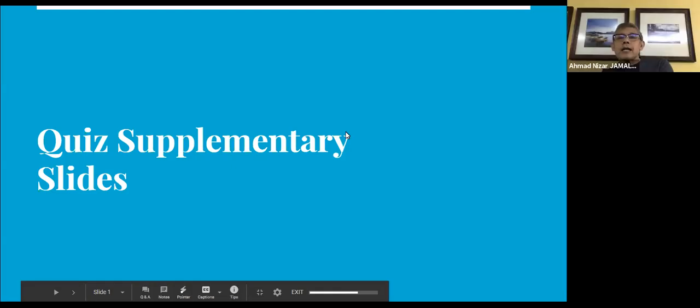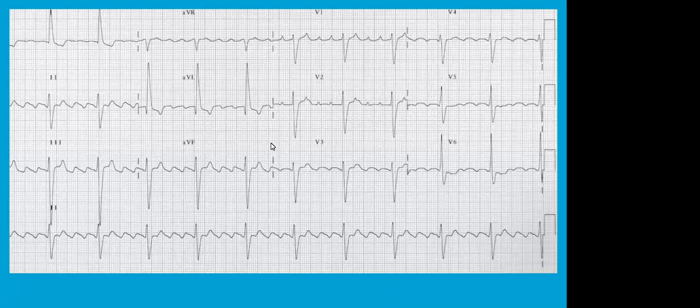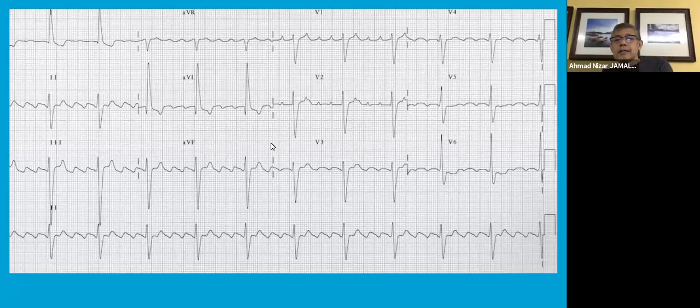Let's go to the first slide. Next slide, please. Okay, that's the ECG.